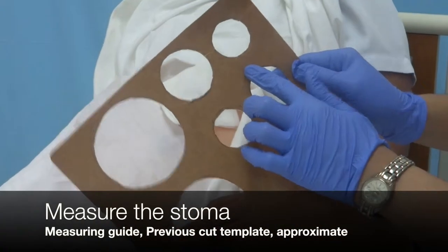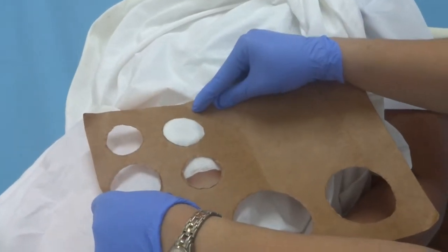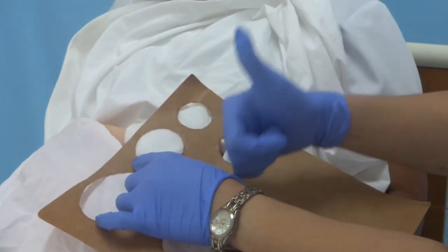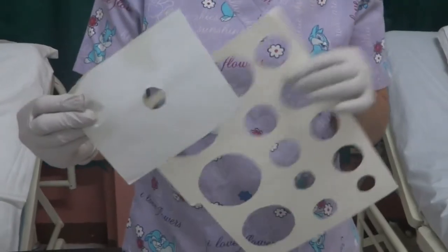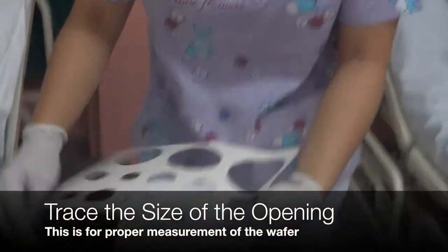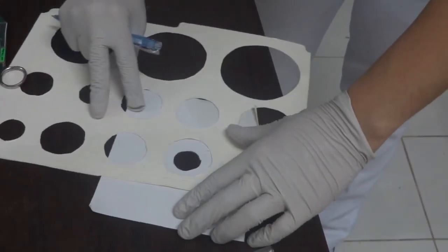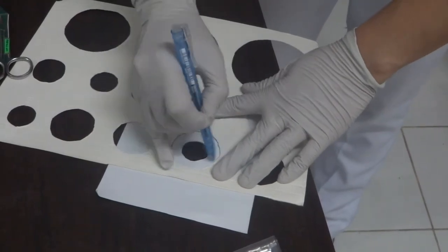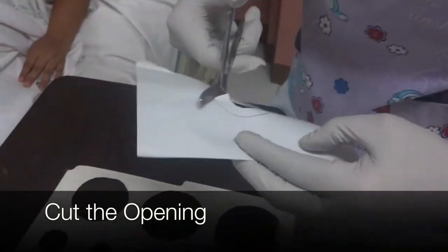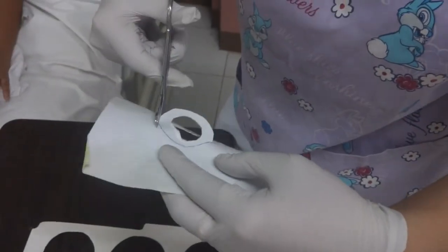Measure the size of the stoma in one of the following ways: using a standard stoma measuring guide placed over the stoma, reusing a previously cut template, or measuring the stoma from side to side, approximating the circumference. Trace the size of the opening onto the paper on the back side of the new wafer. Cut the opening — wafer openings are approximately 1/16th to 1/8th inch larger than the circumference of the stoma.